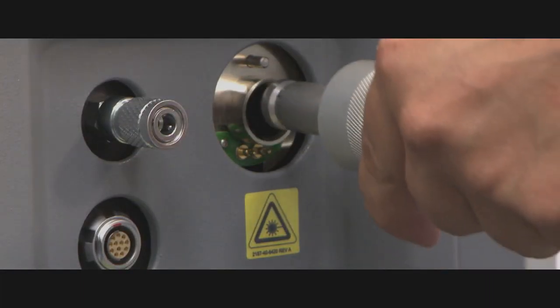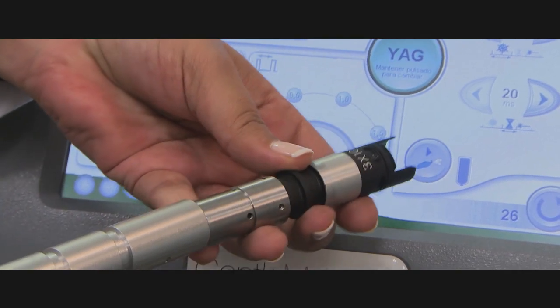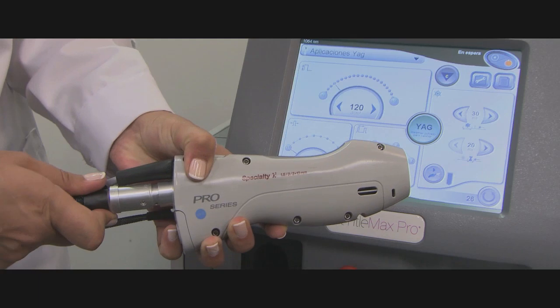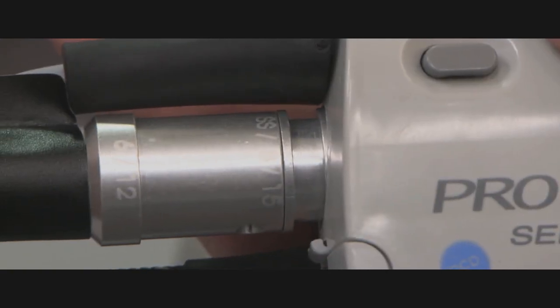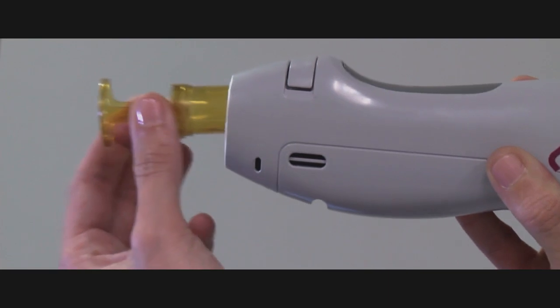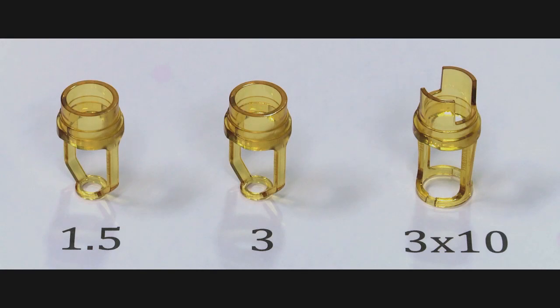The vascular specialty delivery system must be attached to the device. Select the appropriate spot size slider attachment and attach it to the fiber. The slider is then inserted into the specialty handpiece until the spot is locked into place at the marking SS. The appropriate distance gauge is then attached to the end of the handpiece, depending on the spot size selected.